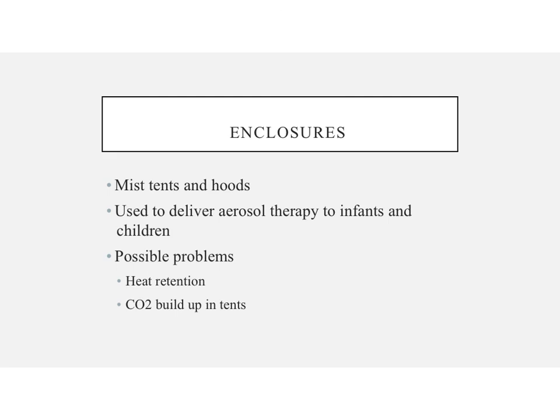Tents are usually used to treat croup, but these do pose some possible problems. So heat retention. So you have them in an enclosure, there's not as much airflow through there, so they can heat up faster. There can also be CO2 buildup in tents, so you want to make sure that if you're using these, that you read the manufacturer information so that you have the proper flow settings.